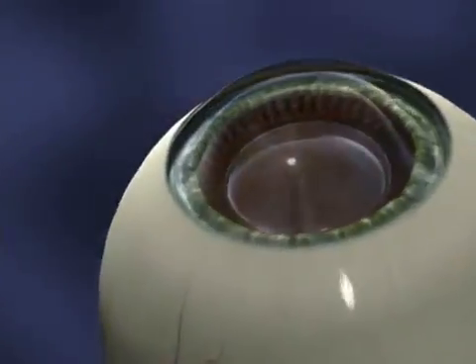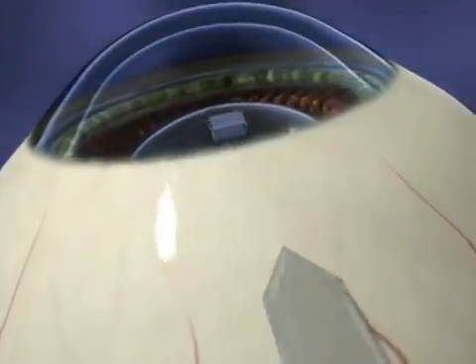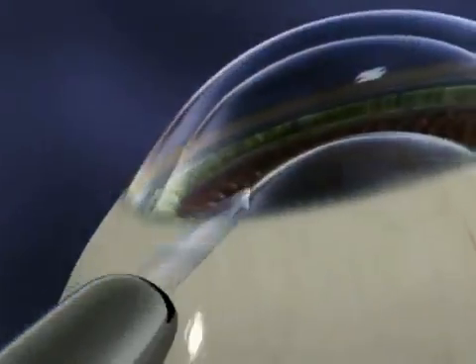Once you're comfortable, your surgeon will begin the procedure. First, the doctor will create two small incisions at the base of your cornea that will be used to position the lens.